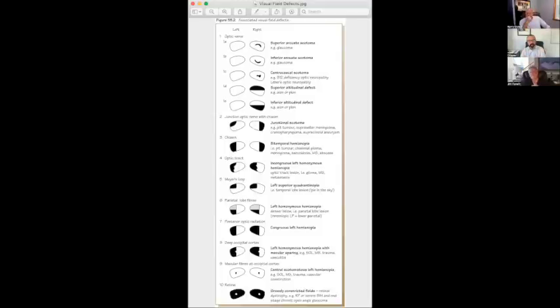But I think at this time, in 2022, it's fun getting into, oh, the problem is here and here and here, right? But in these times, imaging technologies are so available. I think the visual field function is more like the detection of the problem and then referring the patient to the right specialist.